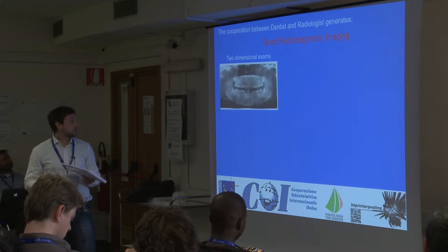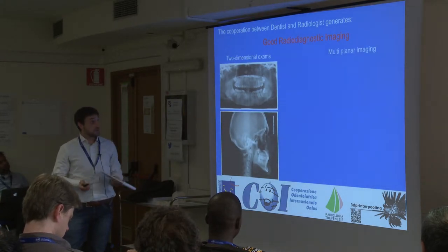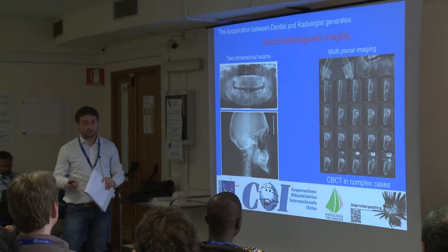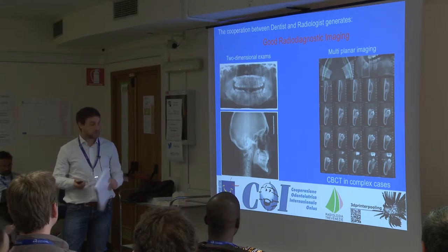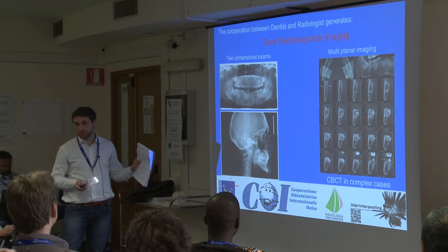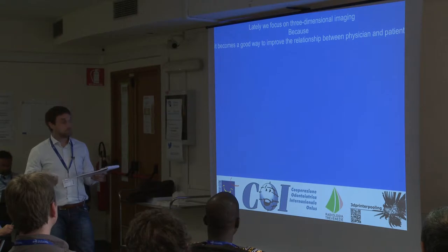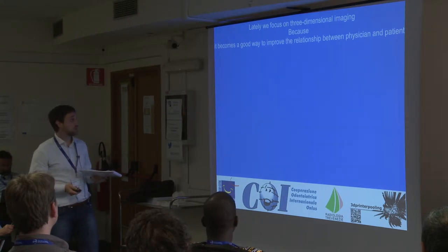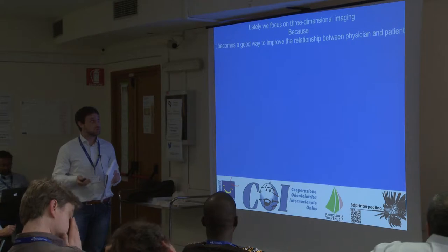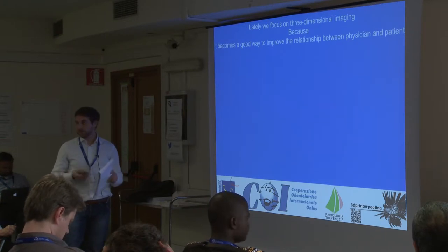Normally, in the simple cases, there are two-dimensional exams like panoramics or teleradiography, or multiplanar imaging that are made with CBCT, computed tomography, for the complex cases. And that is the important thing that we do lately. And we focus on the three-dimensional imaging, because the three-dimensional imaging became very important for the dentist, because it is a good way to explain the disease to the patient.